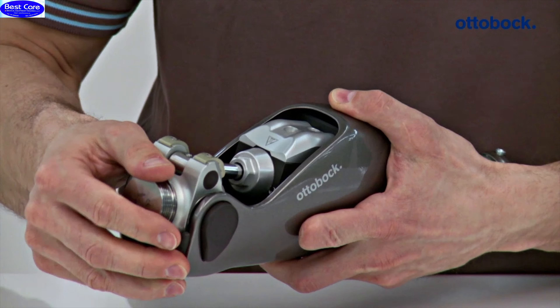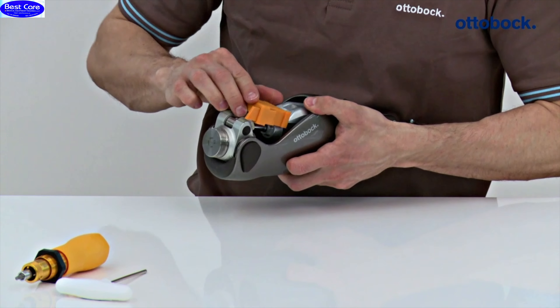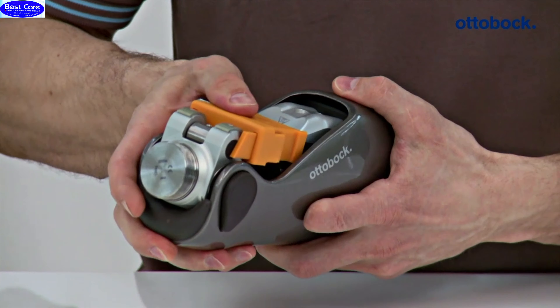Check whether both flexion stops are mounted on the knee joint. Then set the knee extender onto the hydraulics housing and slide it into the stop.